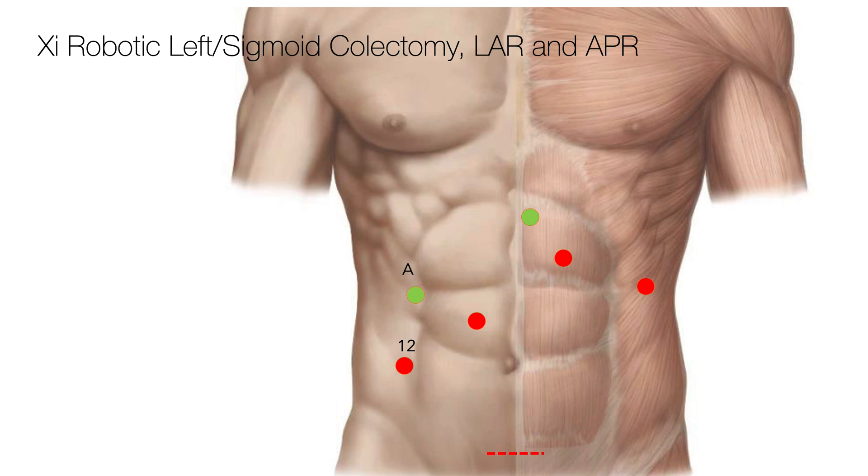This is my trocar placement for a robotic colectomy distal to the splenic flexure. I like to use the same setup for any of these procedures and it works quite well. I start off just above and to the right of the umbilicus. I use a Veress needle to insufflate and then I place an eight millimeter robotic trocar.